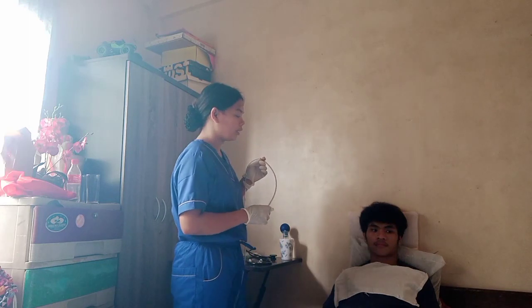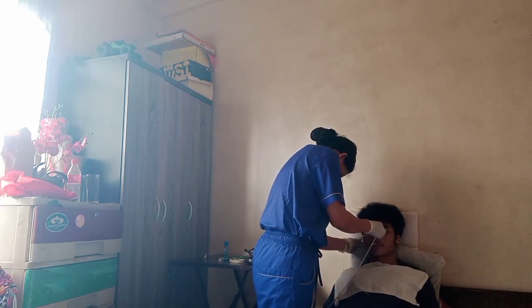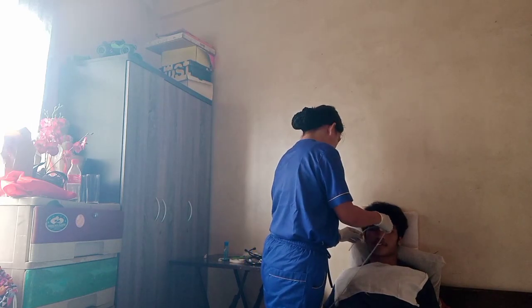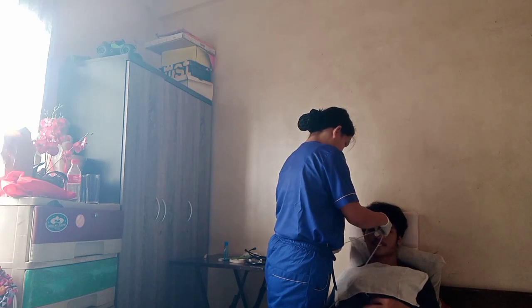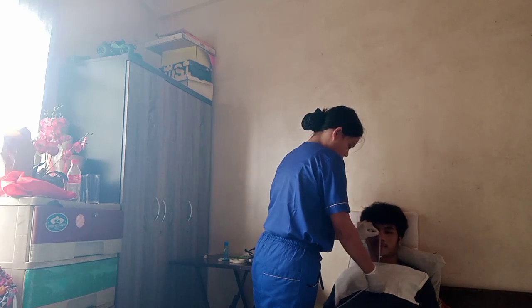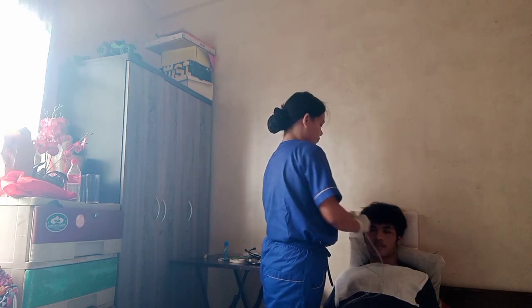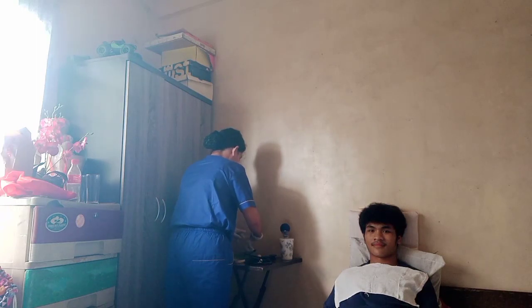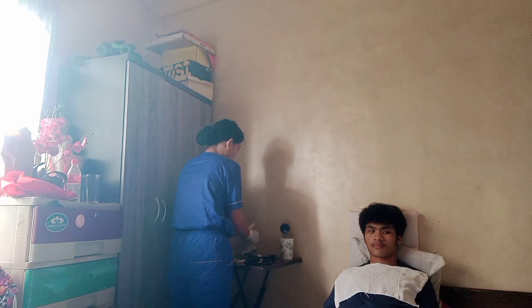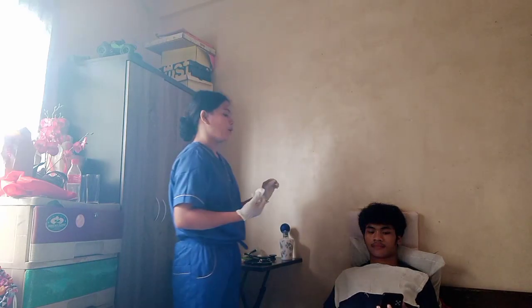Then determine the appropriate length. Then after that, cleanse the nose of the client by using cotton with alcohol.